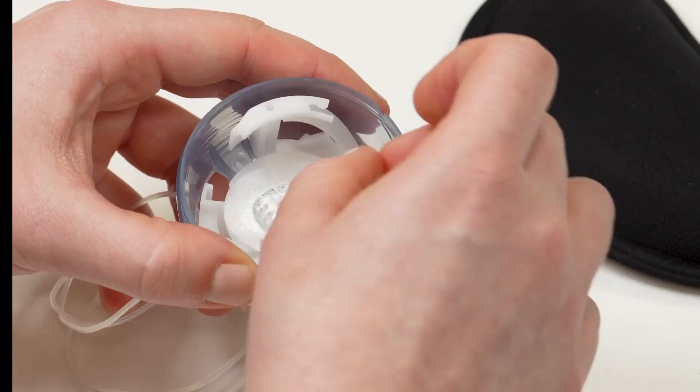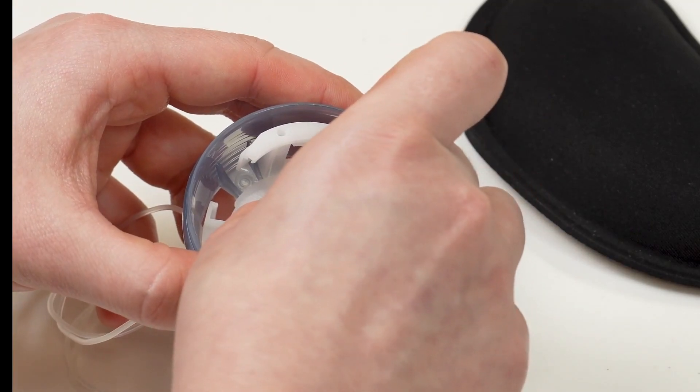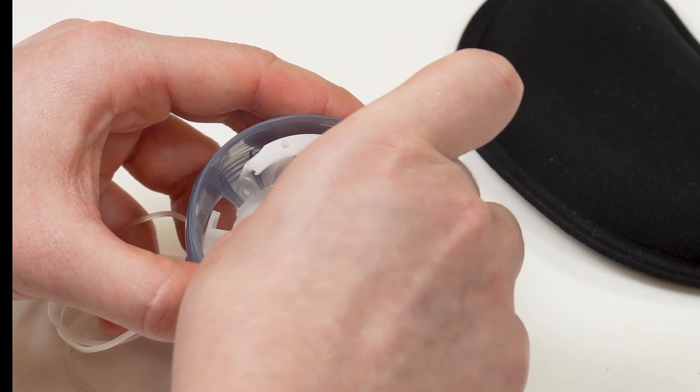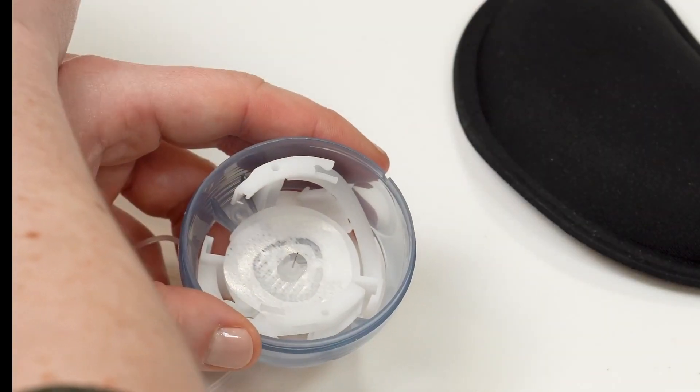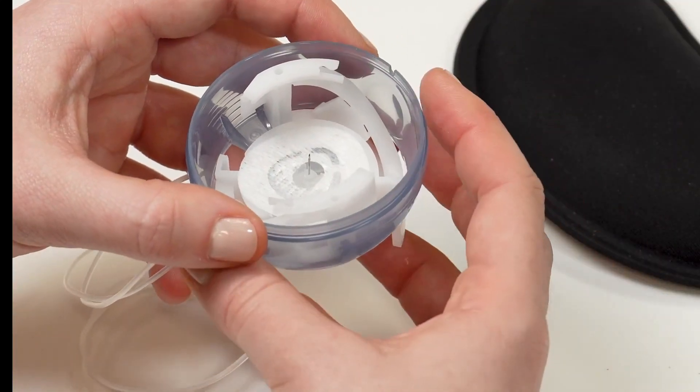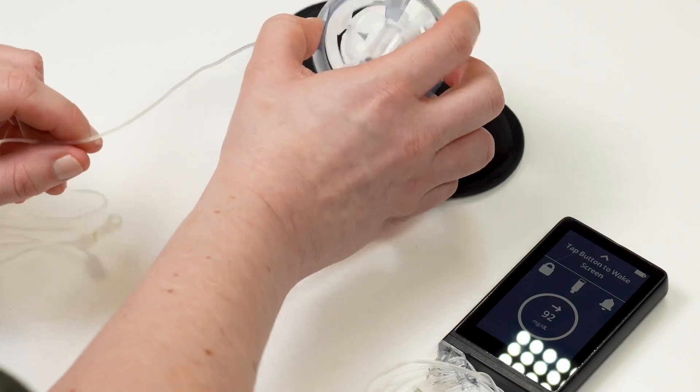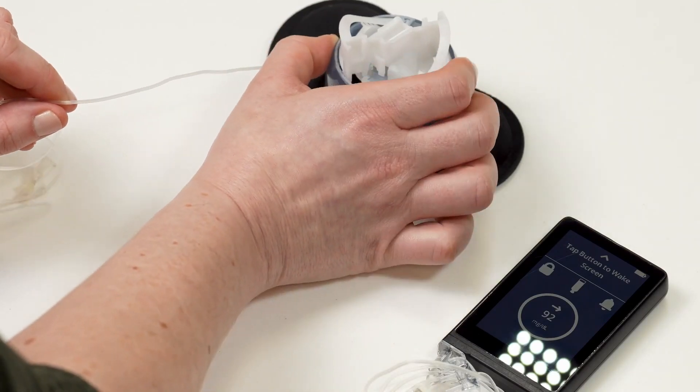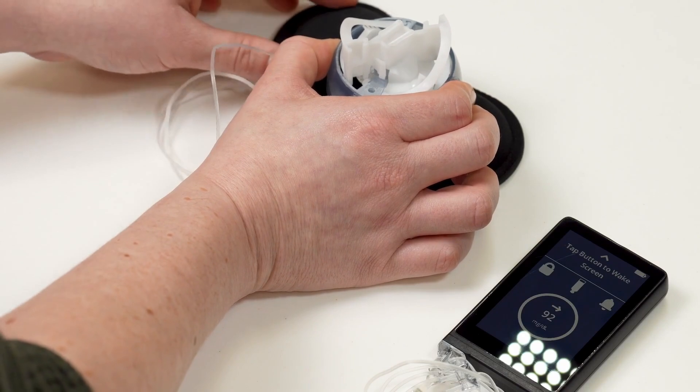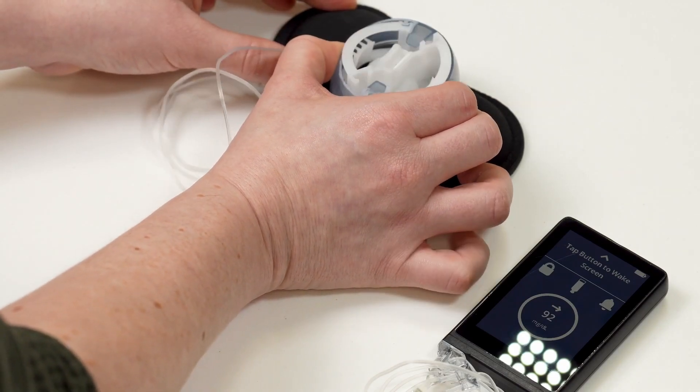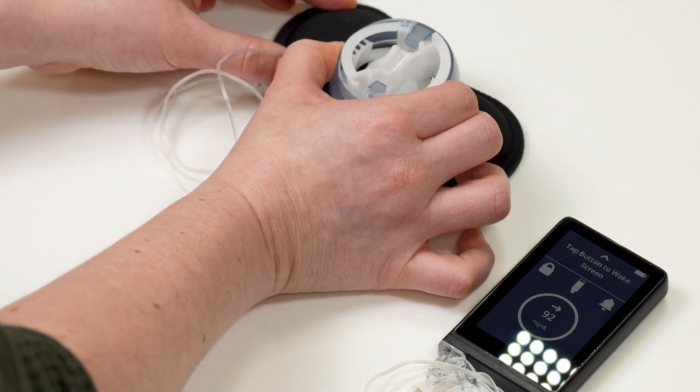Gently twist the blue needle guard off of the needle. Keeping the tubing out of the way, place the inserter on your chosen insertion site on your body. Put your fingers on the circles on the outside of your inserter. Squeeze both fingers at the same time to insert your infusion set.